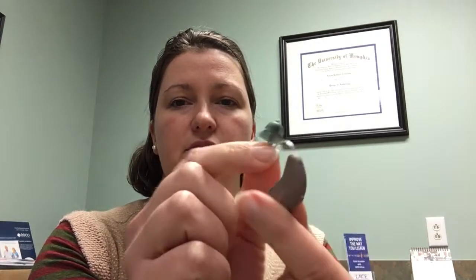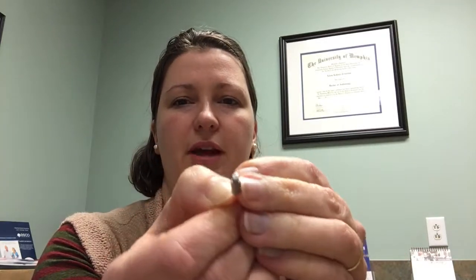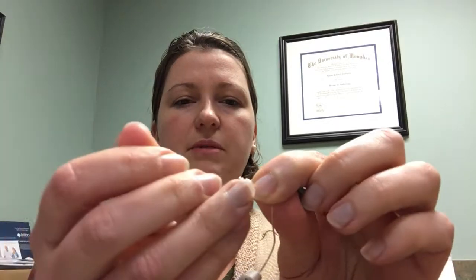This device, it's a little bit trickier. You have to take the dome off to find your little wax guard. Once you get down there, you do the same thing. Straight in and straight out to remove the used wax guard, and then the replacement wax guard straight in. And just put that dome right back over top.